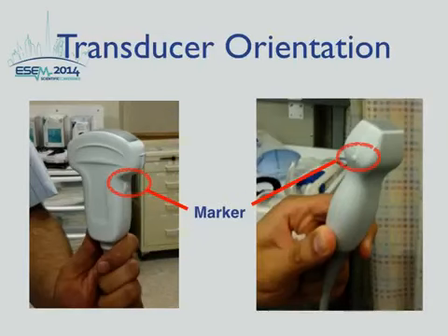When we do point-of-care ultrasound, and most of our imaging, the probe marker usually points to the patient's head or cephalad or to the patient's right. That's a very important point to keep in mind because that's going to help you understand the probe orientation and the image acquired.